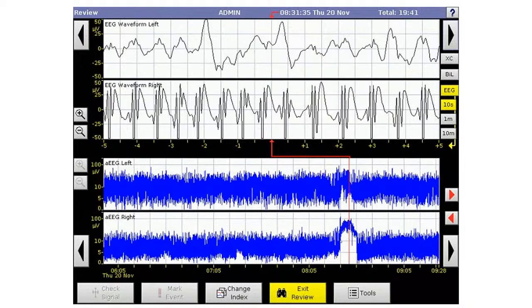This is combined with the fact that over 10 microvolts, remember, we move into the logarithmic part of this scale. Instead of there being only 10 microvolts between here and here, once we're above this line, the equidistance between these two lines is 90 microvolts. So the seizure voltage is high, but it's also in a very narrow bandwidth, in the sense that there's not a lot of variability, which is what causes the shrinking. But you can see that the total amplitude is increasing.